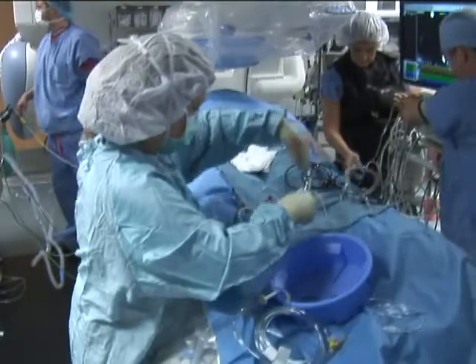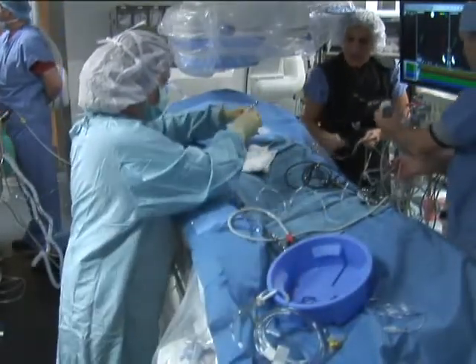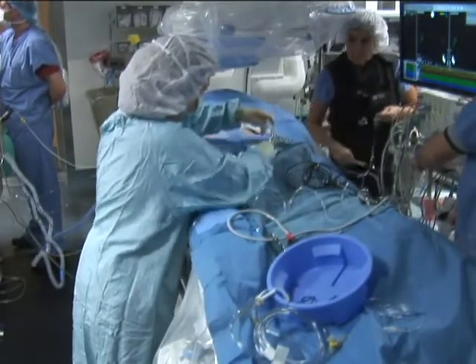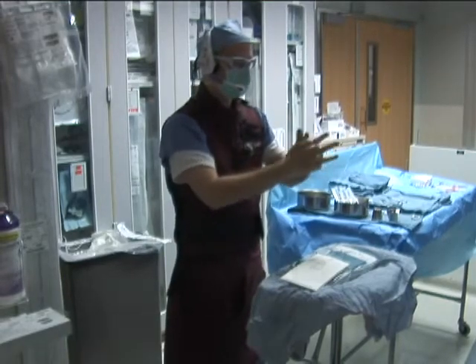The catheter cables are plugged into the appropriate locations in the mapping system computer or pin block to allow monitoring and recording during the procedure. The operator performs a sterile scrub and dons a sterile gown and gloves.